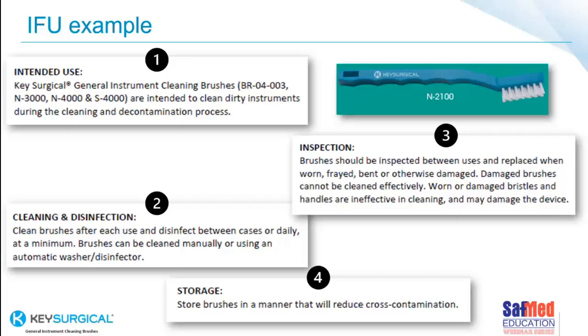Here it says that after each use, we need to clean and disinfect the brush itself. That's important as well. It says over here, at the very least, we need to disinfect them daily. Now, brushes that you buy for the right purpose can in fact also be cleaned and disinfected in an automated washer disinfector. They're able to withstand the high temperatures of a washer disinfector process. So isn't that something you should be considering? How are you cleaning and disinfecting your brushes?